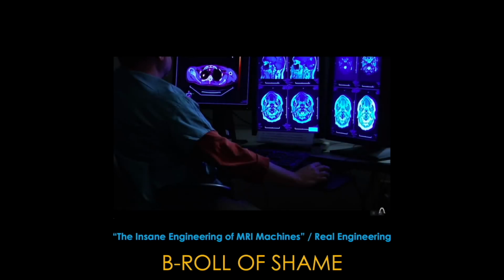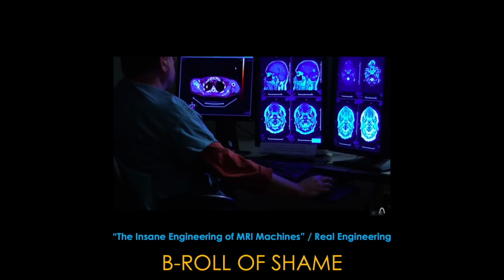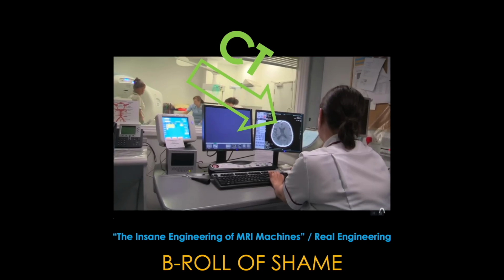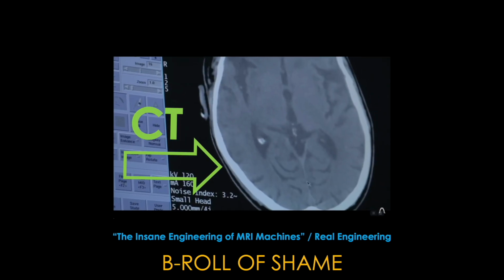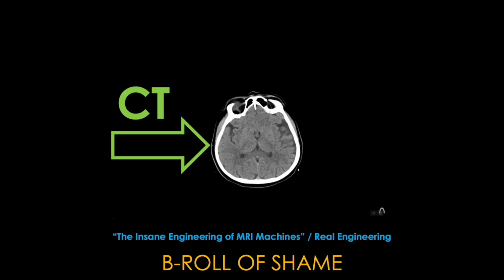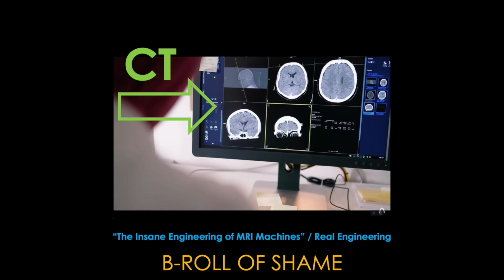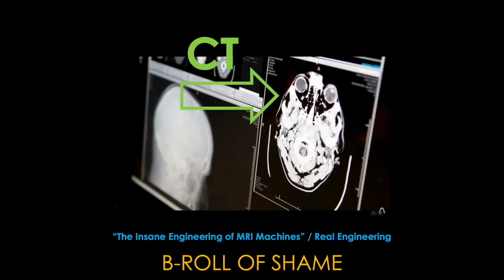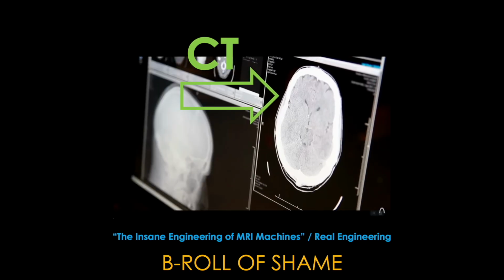So we're going to finish this up with a few clips, starting with the B-roll of shame. Magnetic resonance imaging, however, relies on something far less intuitive: the quantum properties of the hydrogen atom. For research purposes, MRIs can produce even higher magnetic fields, up to 20 teslas. This framework can be extended to 2D grayscale geometries. In reality, what does this mean for the spinning hydrogens? What is the physical representation of these patterns? The MRI machine is a truly astounding piece of electronic technology. Come on now, this is a lecture on MRI. You can't be showing pretty CT pictures while discussing MRI and hoping no one will notice.